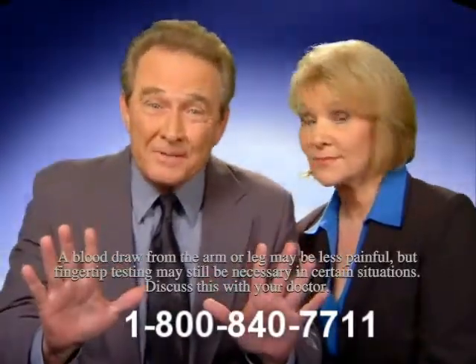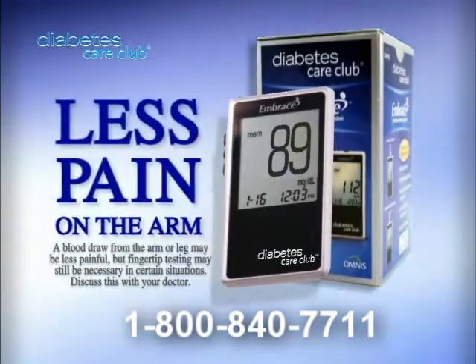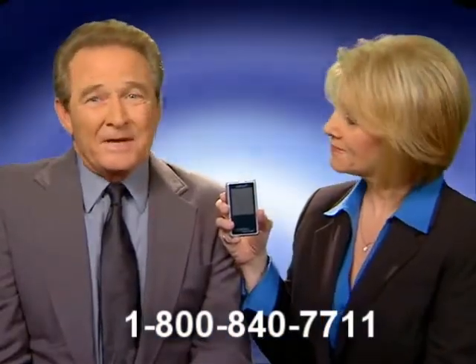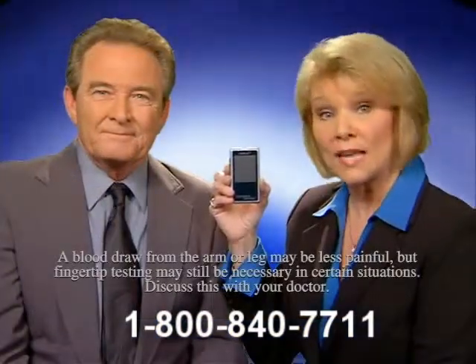You don't need to stab your fingertips anymore. The Embrace Meter from Diabetes Care Club is easier to use and nearly painless. And the best news is that Diabetes Care Club would love to send you one of these meters. This method hurts less.